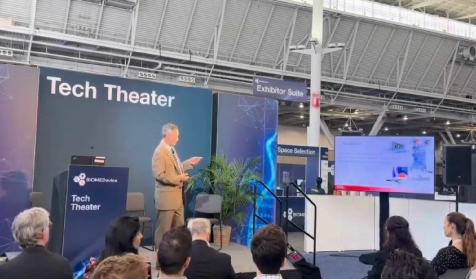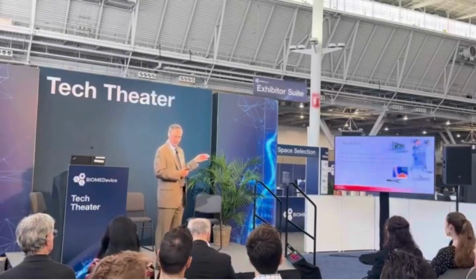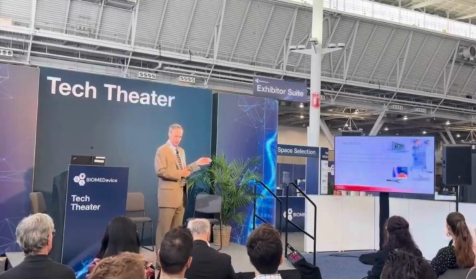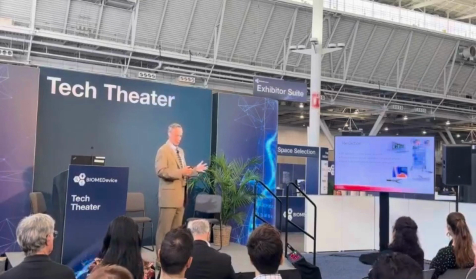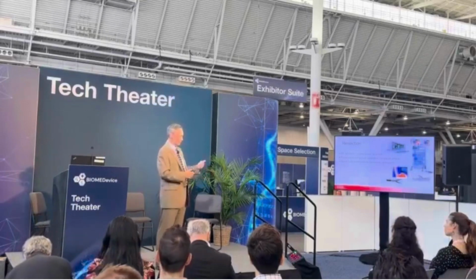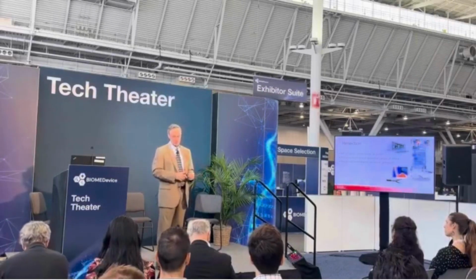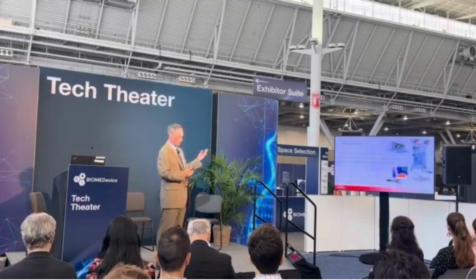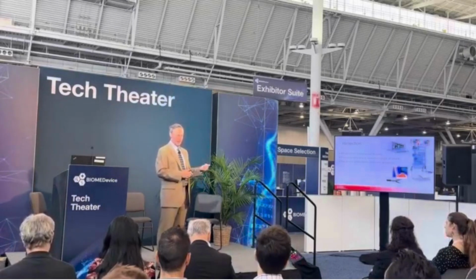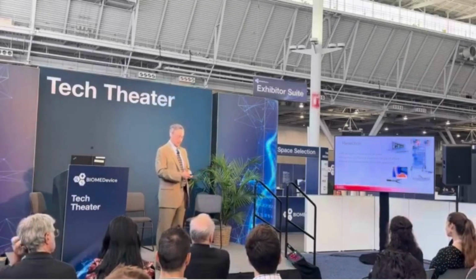I put the arthroscopy cart up here because all of those things have to work together, but they can't interfere with each other. So you get EMI interference, you get ESD, you have all kinds of elements that occur. So you have to make sure all the equipment works. If you introduce something new, you need to understand what's there. And you need to make sure that, again, you don't become a big part of the procedure. You want the instrument to work, you want the box to work, but you don't want to turn on an RF device and have it scramble your monitor. Not that that ever happens, but it does.